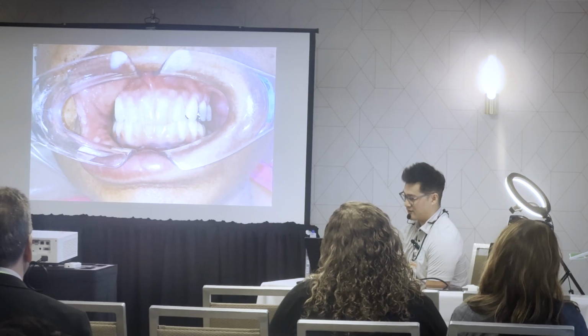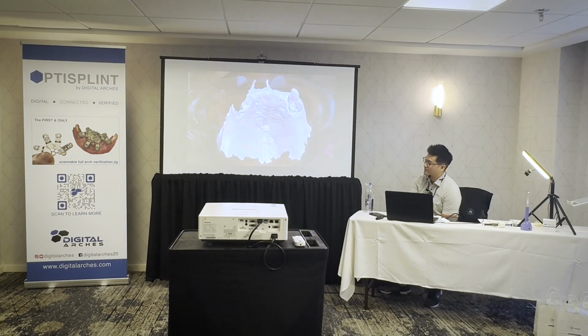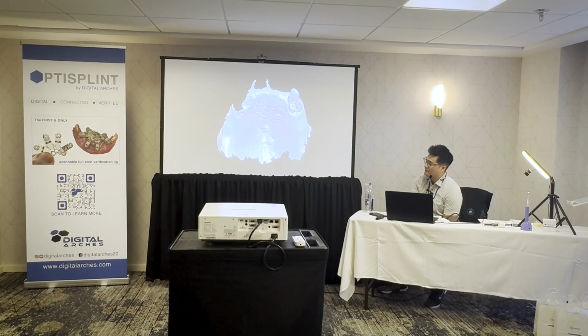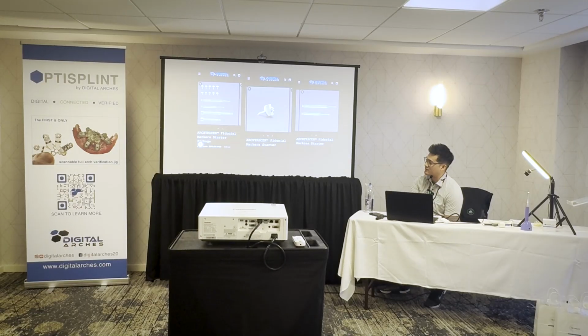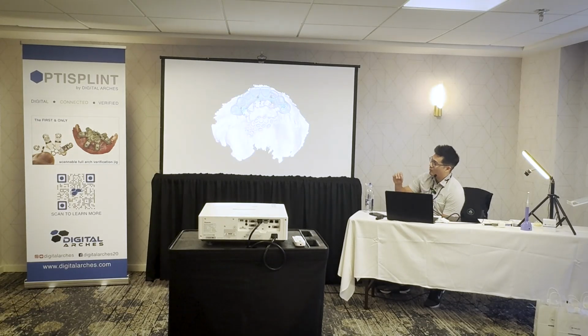My bite's right on. And so I didn't do a lot of these cases guided. You could also do them freehand. This was just with screws in the palate, but same thing. Your pre-op scan, screws in the palate, post-op scan, screws, ARCHTRACER, which is launching soon. It was nice because there's a lot of geometries on that, which makes it easy to register things together. But this is at the end of the day the same process. Once I get the scan, once this is printed or milled, it's literally 10 minutes. It's not a long process.